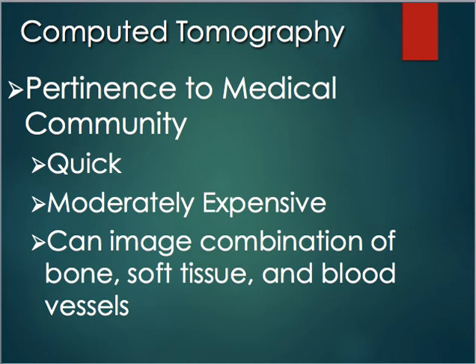So what they thought was the diagnosis originally prior to the scan, after they were able to see the imaging, they changed their diagnosis 42% of the time. That's huge. What that's saying is CT is able to truly diagnose something that maybe the ER doctor was guesstimating. And in abdomen CTs, the diagnosis changed 51% of the time.